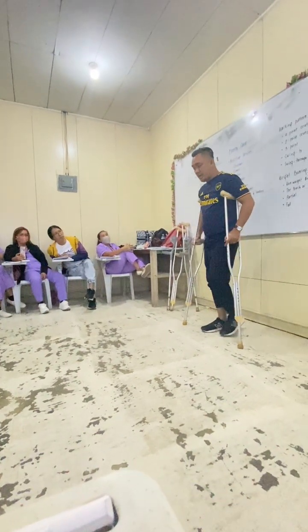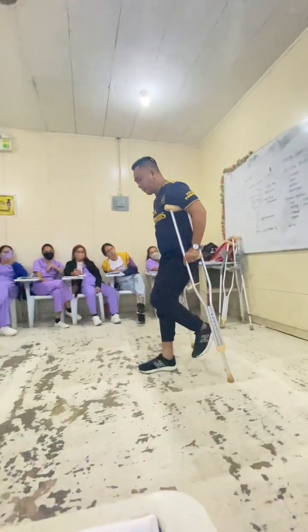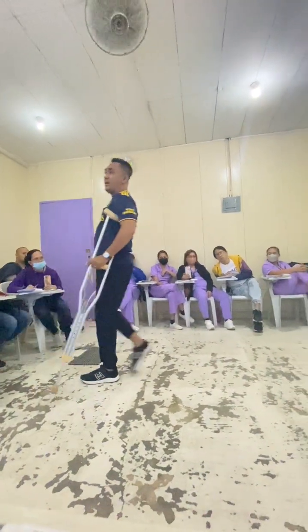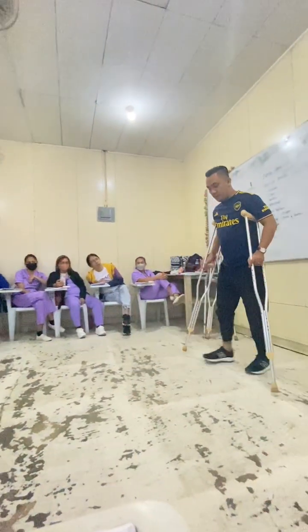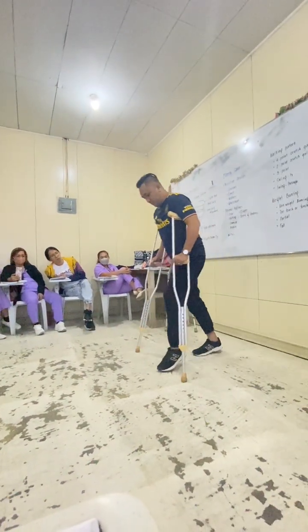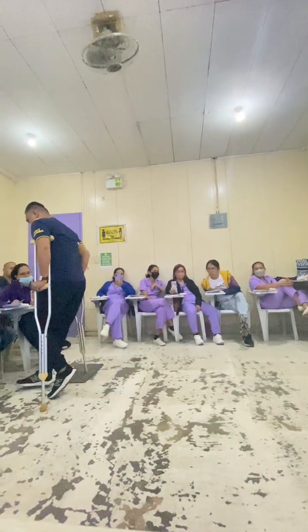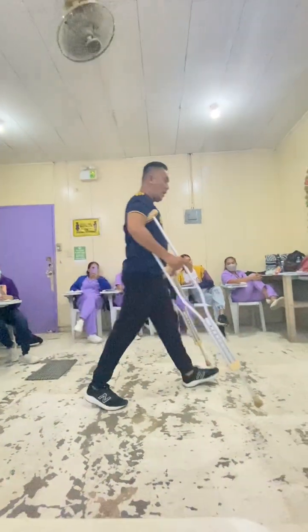So let me go back over everything. Non-weight bearing. Okay. Then we will go with touch-down weight bearing. Okay. Then we have partial weight bearing.